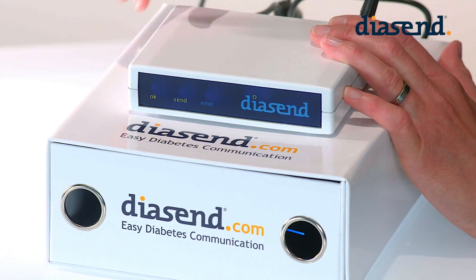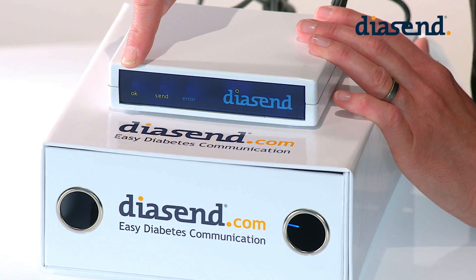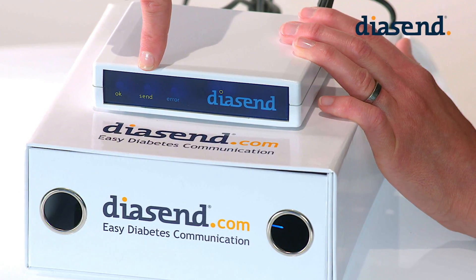Once you've connected the power supply you can tell that the transmitter is on by the green light that's flashing intermittently. Once the initial green light changes to blue the transmitter is ready to use and you can upload your first device.